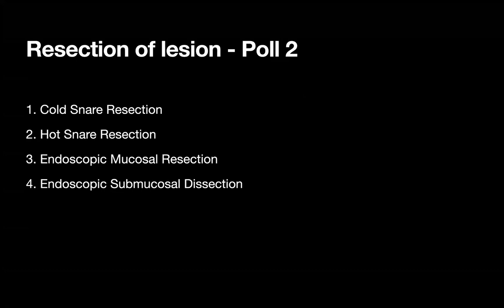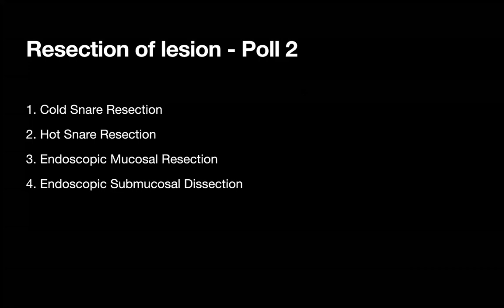I think here what you need to be looking at is the fact that when the lesion is sessile, there is a possibility that there could be a focus of cancer that the surface examination does not detect. The reason is that it could go from the inside part of this part. So we know that data from the Japanese, for example, show that the accuracy of just looking at the surface is lowered, or the sensitivity is lowered.